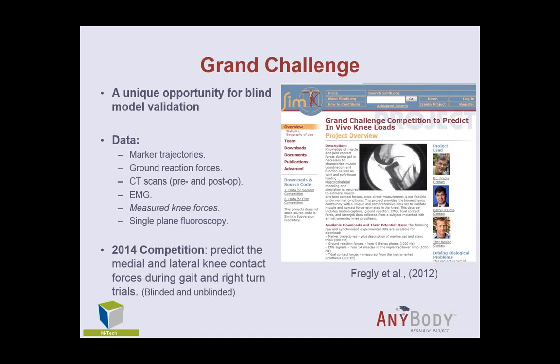I'll just give you a brief introduction to what it's all about. The idea is that they wanted to challenge the musculoskeletal community to actually critically validate their predictions that they've been doing for forces within the knee. So they developed a knee that can measure the contact forces, actually all 6 force and moment components in the knee, and implanted this into patients.